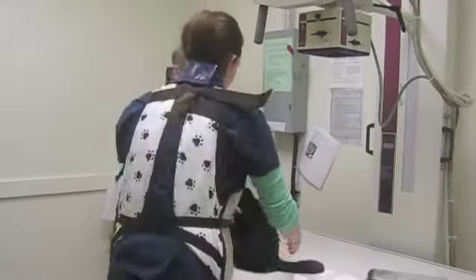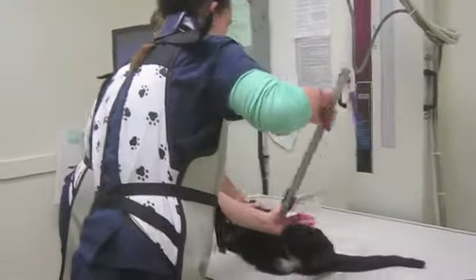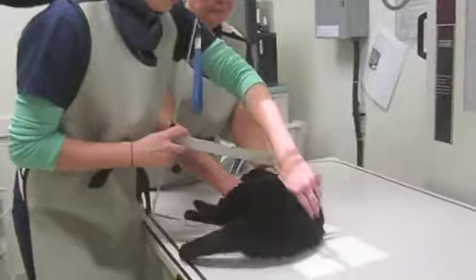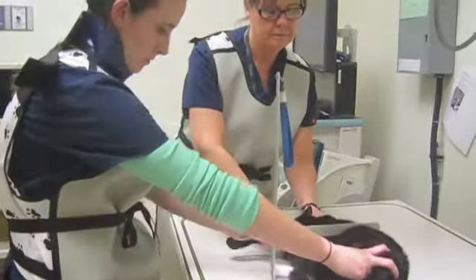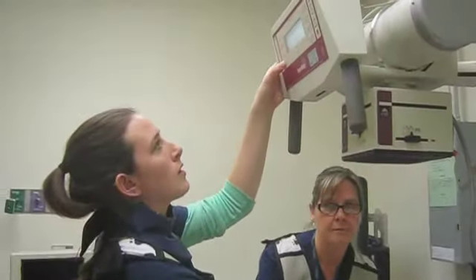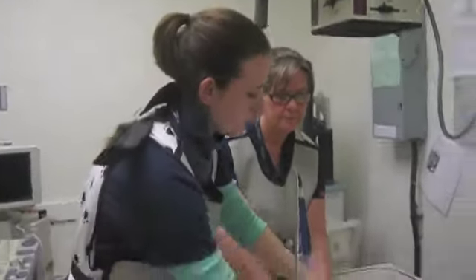For a GI contrast study, x-rays need to be taken at the baseline mark, meaning pre-barium, and right after the barium is given so we can get a clear view of the esophagus. Depending on the veterinarian, times may vary, but according to the text, you want an x-ray at the 15, 30, 60, and 90-minute times after the barium is given.